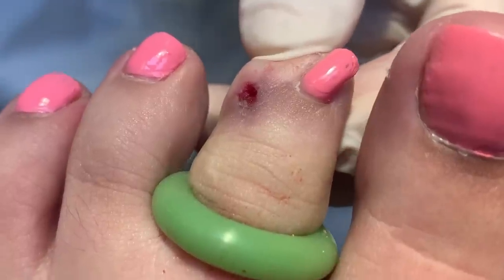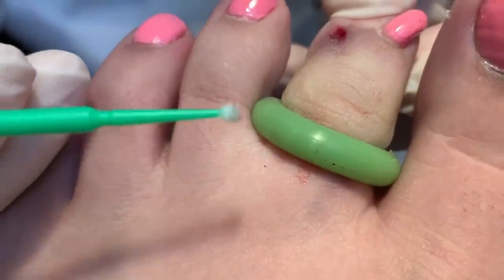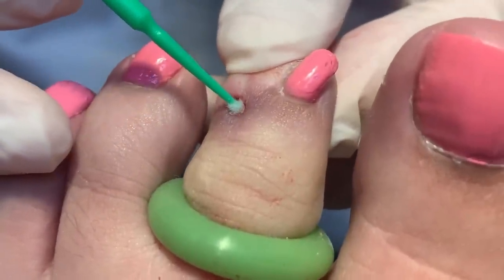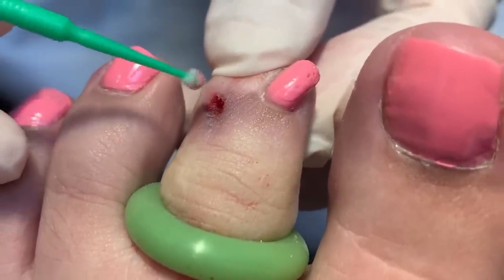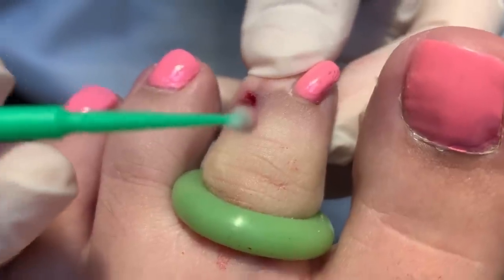But lo and behold, we have this very cute stick right here with a little cotton tip that goes into it, so we can burn this area. I just wanted to film this to show you how cute this little thing is.